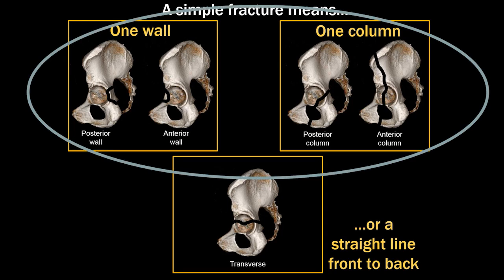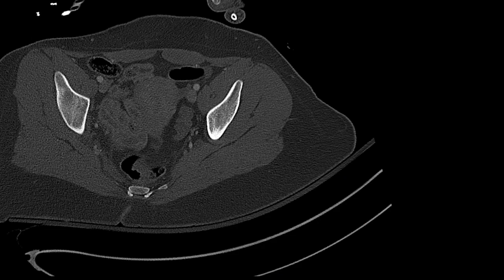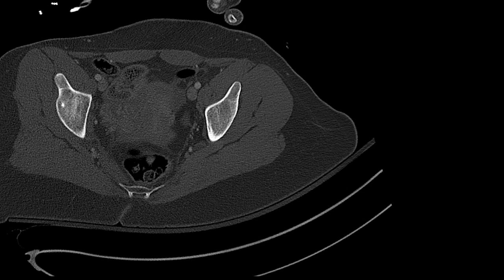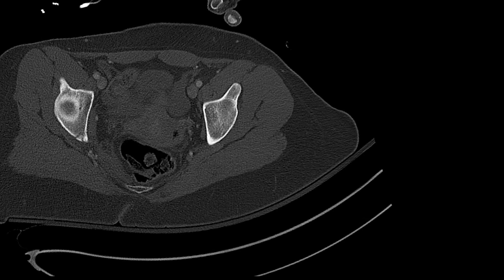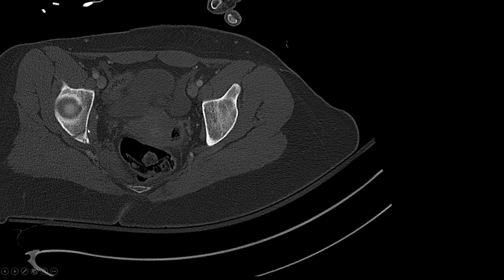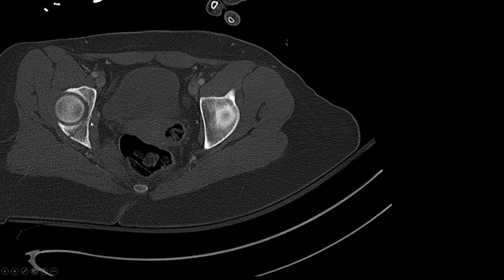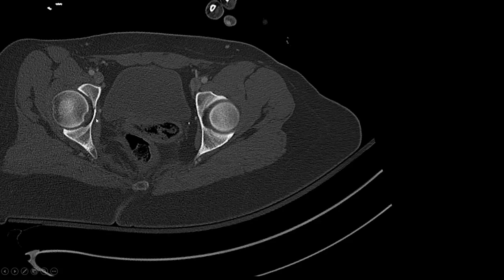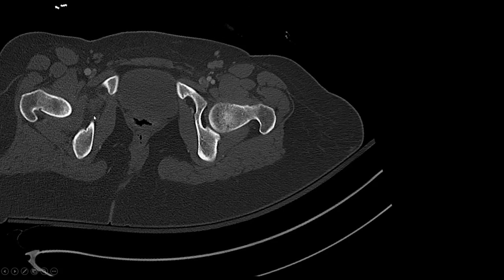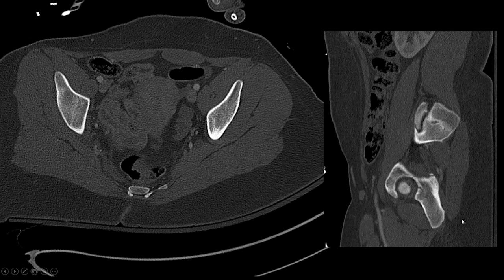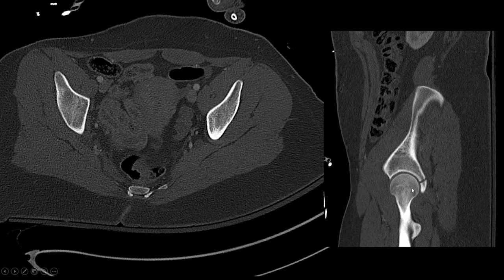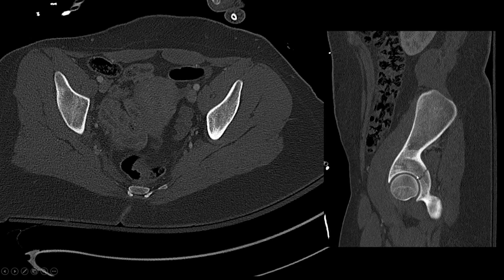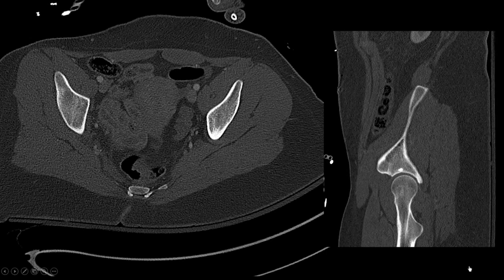Let's be clear on the difference between a wall and a column fracture with this case. On the axial CT, watching the right acetabulum, we see a fracture along the posterior aspect, and we follow it down to see whether it involves the quadrilateral plate. In this case, it clearly does. So with a posterior acetabular fracture involving the quadrilateral plate, we're thinking posterior column fracture. Scrolling through the sagittals, there is that fracture involving the quadrilateral plate — going out the back, clearly a posterior column fracture.